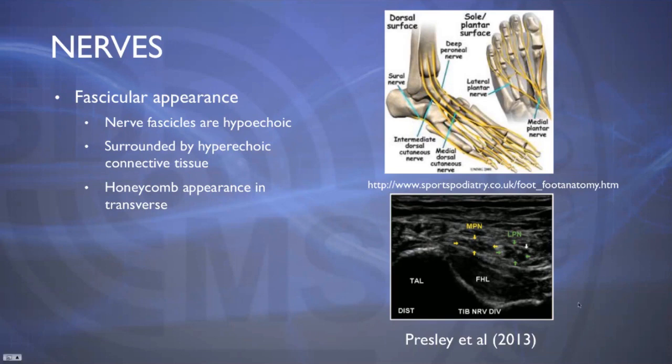This sonographic image is showing you that kind of classic honeycomb appearance, and again, we see that honeycomb appearance in the transverse plane. This is showing you both the medial plantar nerve and the lateral plantar nerve.